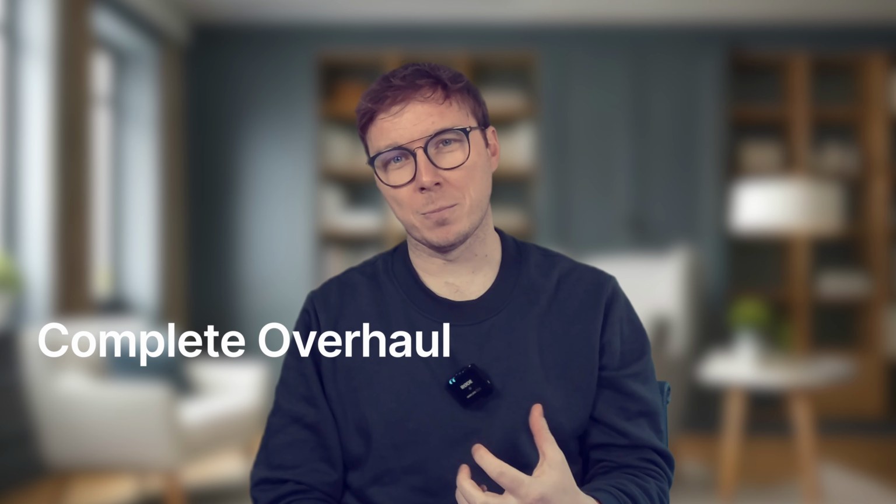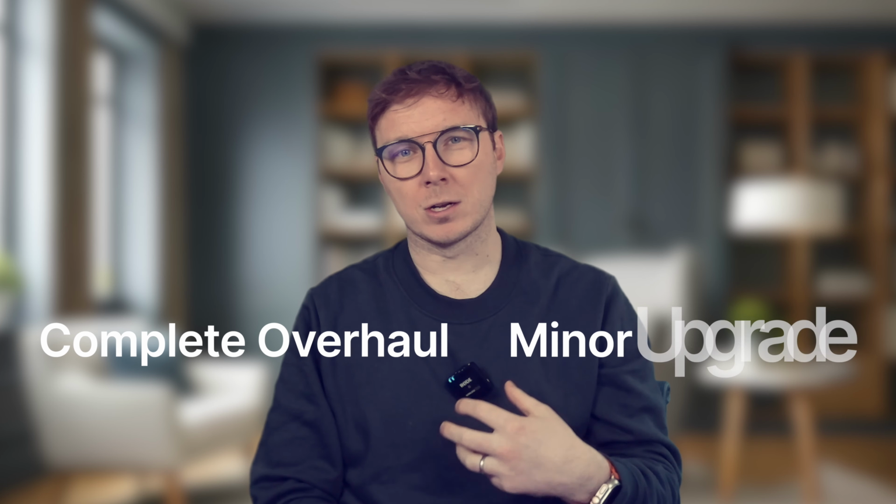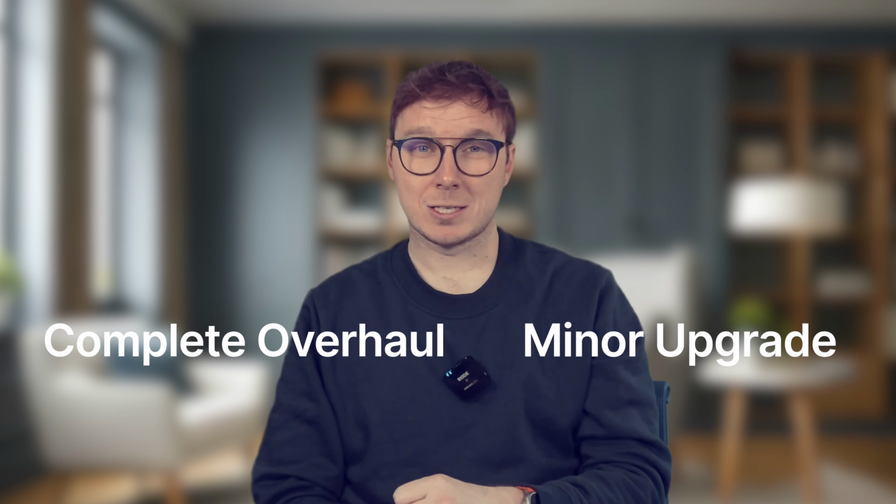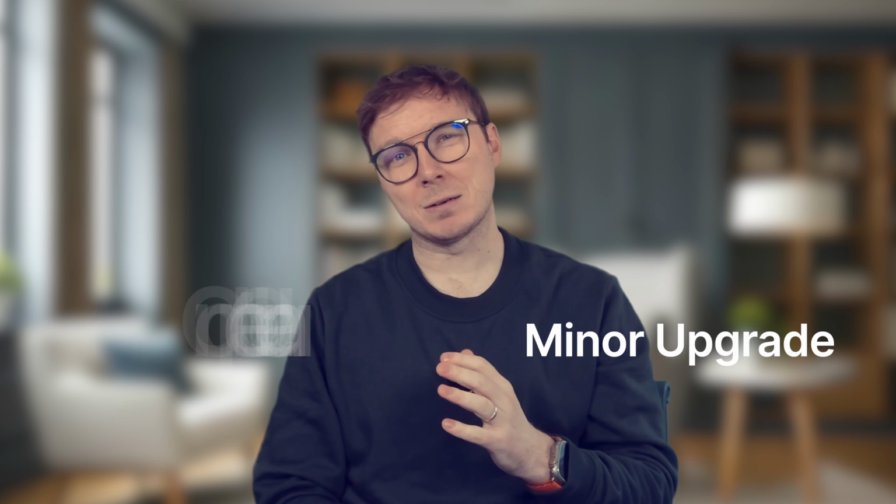So is the Resound Nexia a complete overhaul with a new platform, or is it a minor upgrade on last year's Omnia model? Well, based purely on the specs, I would say it's somewhere in between, but I'd probably lean more towards saying this is an upgrade. It's the same processing chip, it uses the same technology as the Resound Omnia, and the speech and noise and directionality features are the same as the Omnia, but the size being so much smaller and the addition of Auracast are probably a little more than a minor upgrade. They are a big deal. If I had a Resound Omnia currently though, based purely off the specs, I wouldn't be rushing out just yet to get new hearing aids.